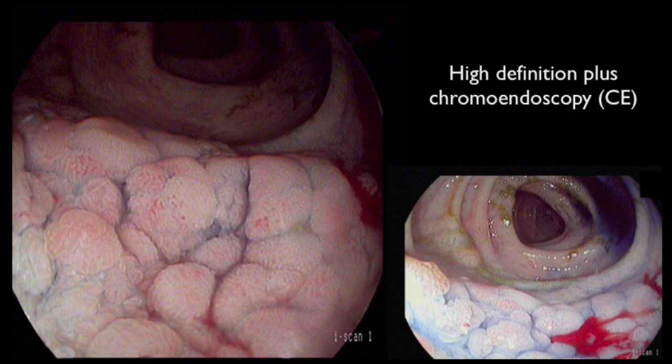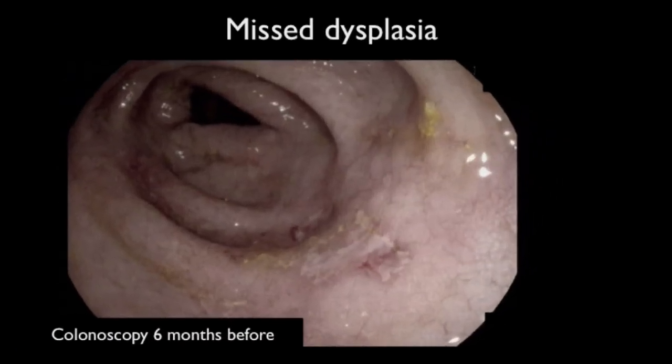Chromoendoscopy helped to delineate the borders of the lesion and highlighted the epithelial surface. Targeted biopsy was taken, showing dysplasia. Endoscopic resection was recommended instead of colectomy. A colonoscopy performed 6 months before showed active colitis but missed dysplasia.